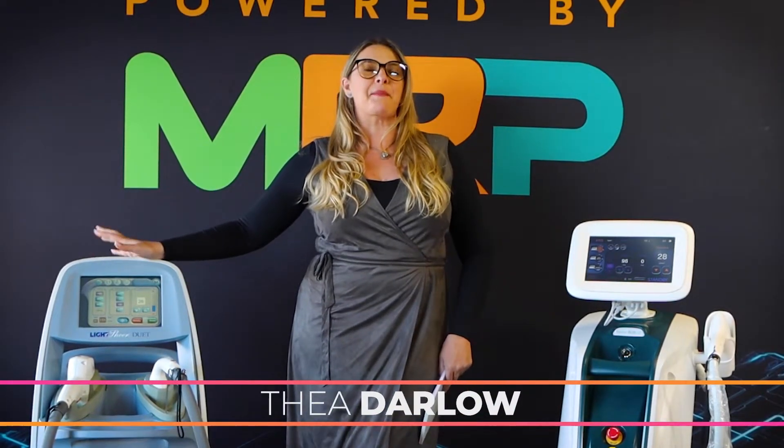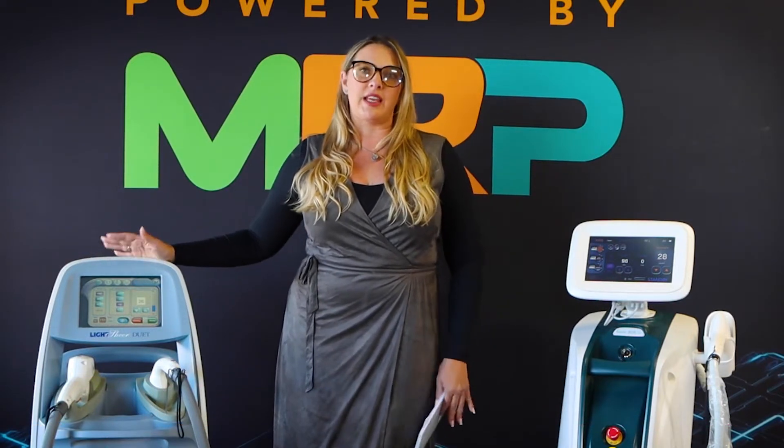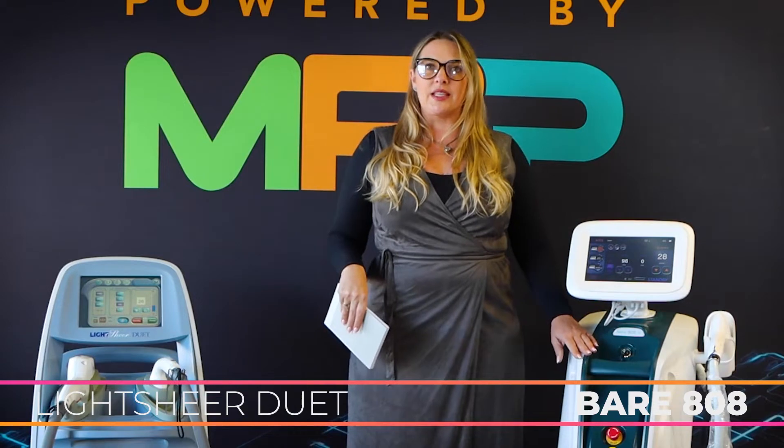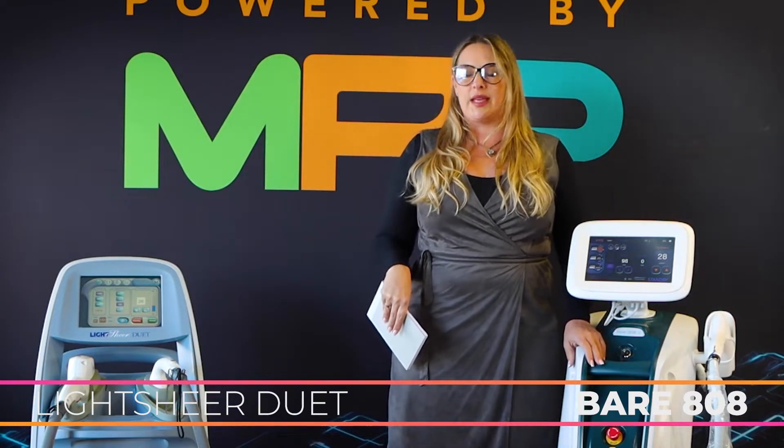Hi, Viandarlo here with MRP, and today we are doing a comparison of diode systems for hair removal. Both systems are in that 805 to 808 nanometer range of diode. We have the LightSheer Duet, and then we have the newest device to our industry, the Bare 808.